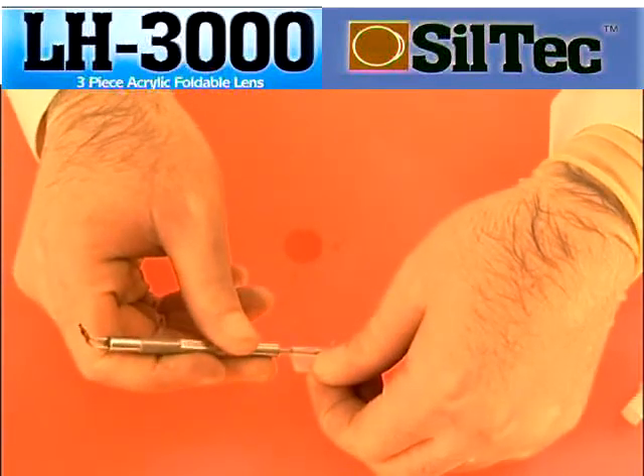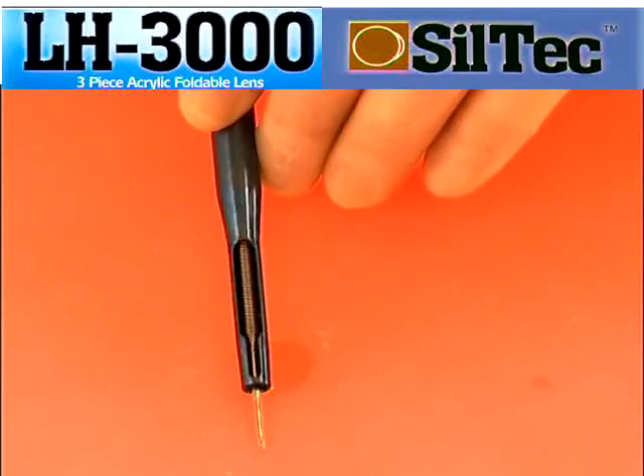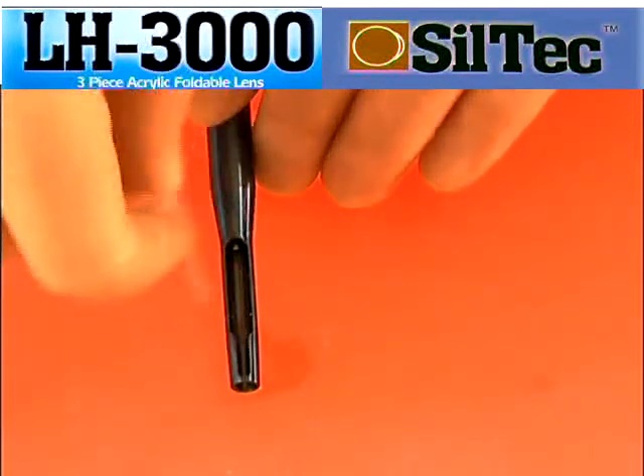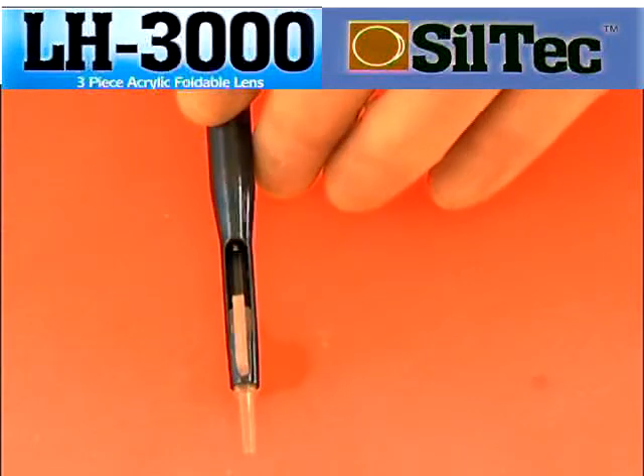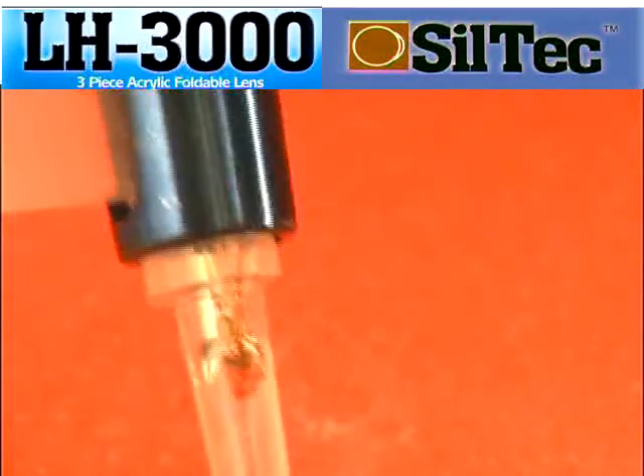Using the tip of the loading fork, push the lens into the barrel ensuring that the tip is pushing on the optic and not the haptic. With the plunger fully retracted, place the cartridge in the injector and push the plunger into the back of the cartridge until it just comes into sight in the barrel.